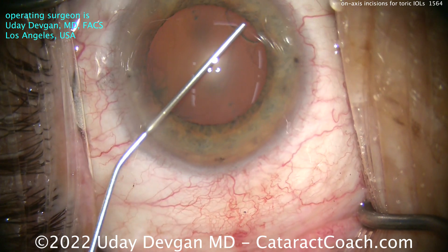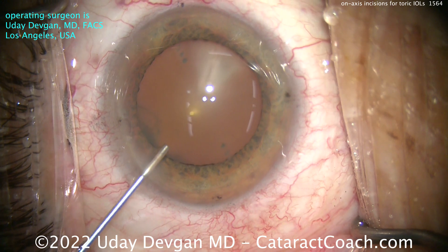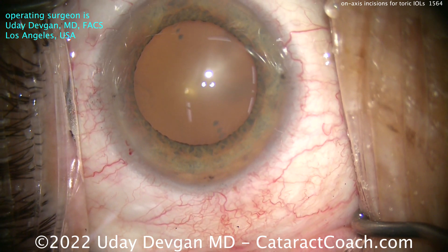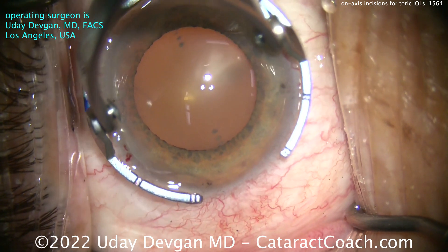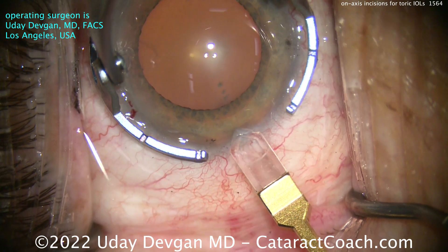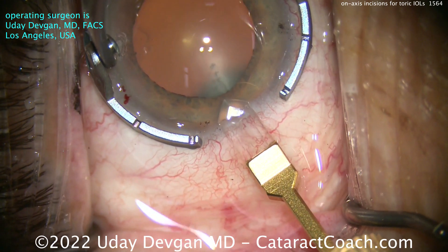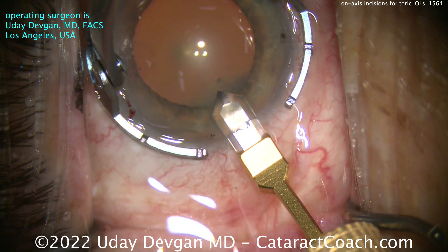Here's the complete cataract case start to finish. The eye is full of viscoelastic — look at the cornea. There are marks already made on the cornea, those three dots on either side, showing me the steep meridian. I'll use my diamond keratome here and make my main phaco incision right on that same axis — that on-axis incision.